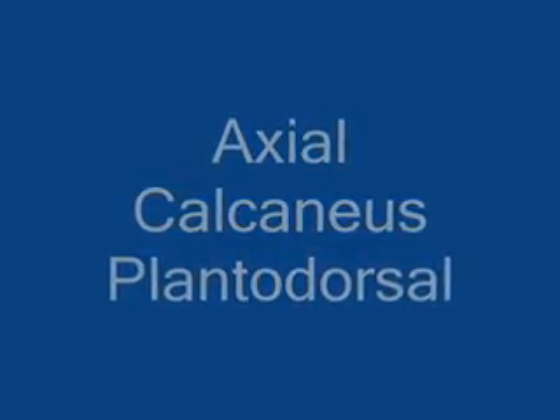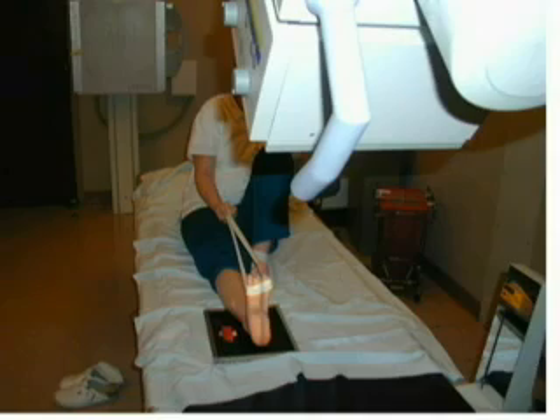The plantar dorsal axial projection of the calcaneus is performed with the patient seated on the table. A lead shield should be placed on the patient's lap for radiation protection. Place an 8 by 10 image receptor under the ankle of the patient's extended leg. Place a long strip of gauze around the ball of the foot.